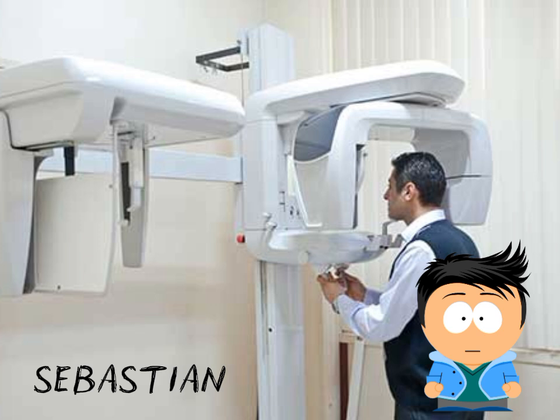Its components are an X-ray tube, a digital sensor, a patient support system, and a control panel. Modern models are equipped with touchscreens.